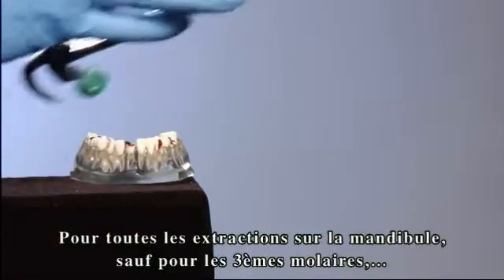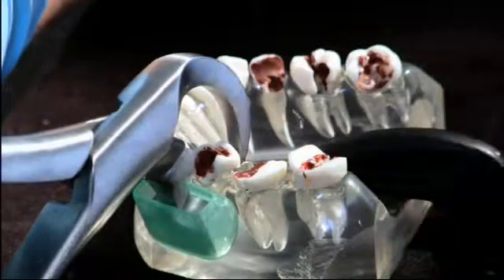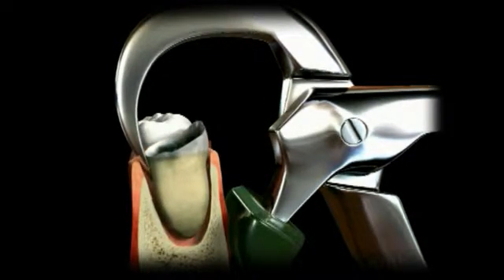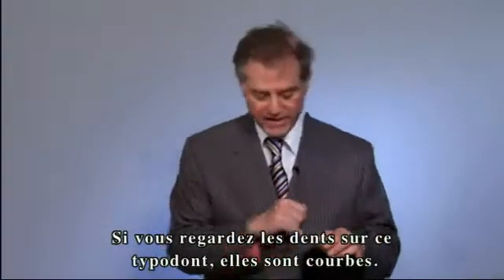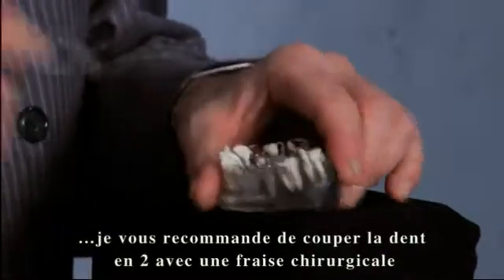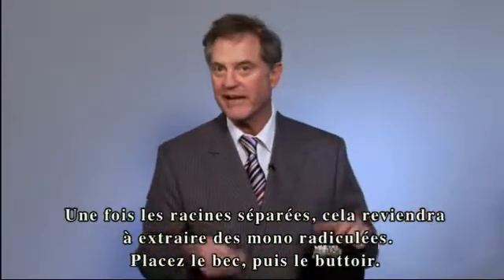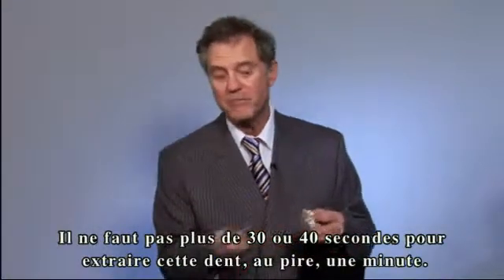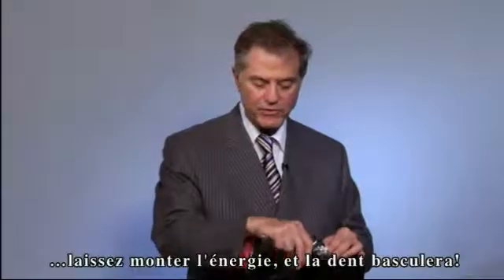On all lower extractions, with the exception of the third molars, you will use the universal lower physics forcep. For lower molars, it's a little different. These teeth are curved. Until you really understand the use of the lower physics forceps, we suggest that you take a surgical burr and cut the tooth in the middle — separate the two roots. Once you separate the two roots, it becomes like taking out a bicuspid. Place the beak and bumper, take them out as if they were individual roots, wait for the energy to build up, and the tooth will rotate out.